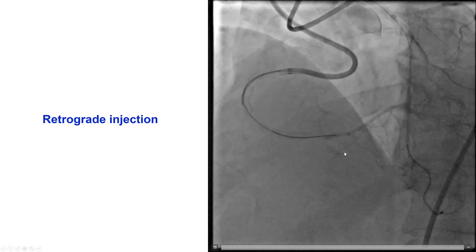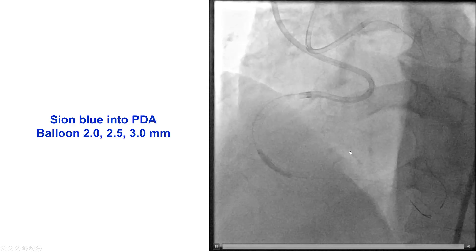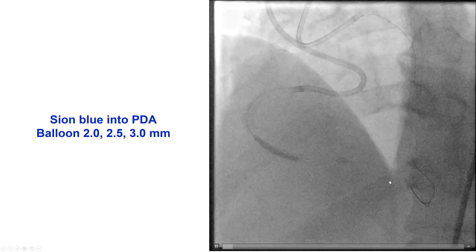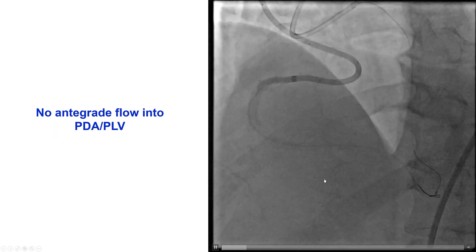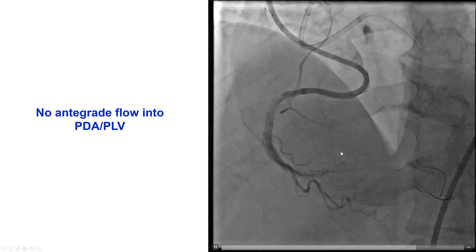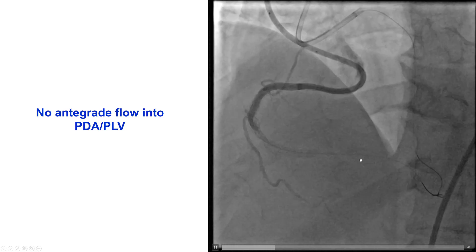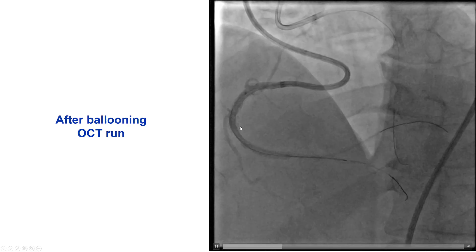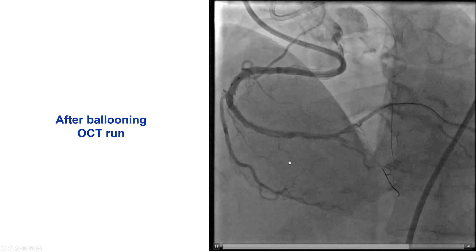Contralateral injection confirmed that we had crossed into the distal true lumen. We then exchanged for a workhorse guide wire into the PDA and performed balloon inflation with serially larger balloons. Unfortunately, there was not really any good antegrade flow, which was of concern. We performed more balloon inflation, and then TIMI-3 flow was established.